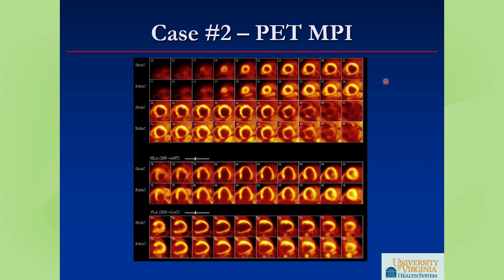You can also see that the cavity is dilated, similar to our last patient. And in contrast to the first patient, the cavity appears to be more dilated at stress here than at rest. And so there was at least visual concern of some transient ischemic dilation.